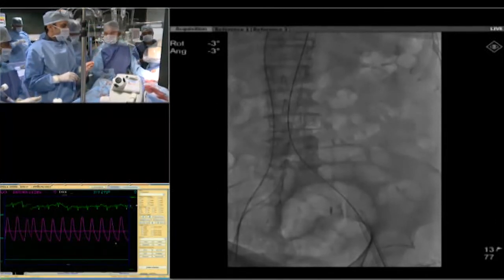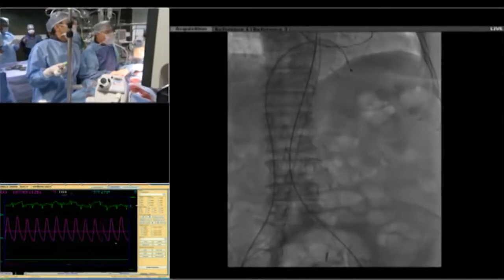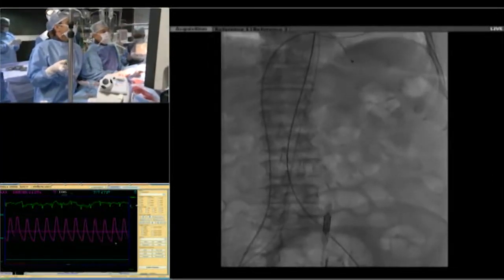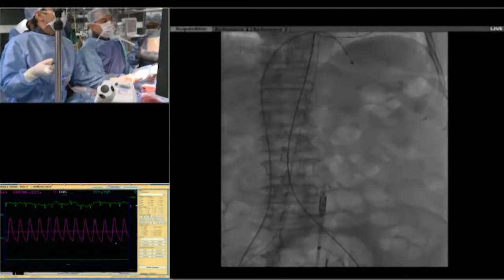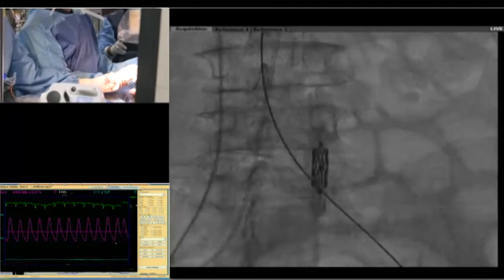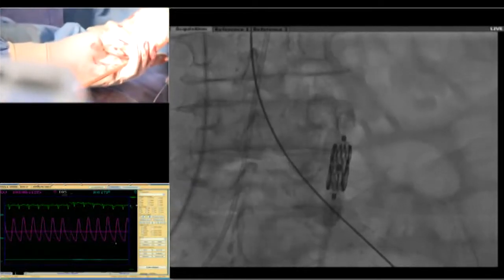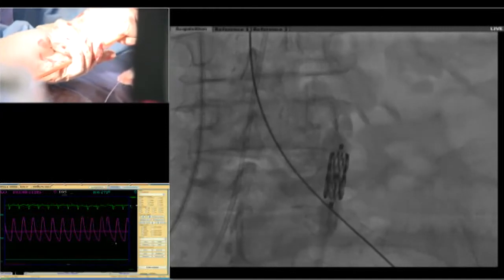So we're ready. All right, so we'll do a fluoro check of the valve. Let us see how it is loaded. It's loaded. Okay, mag up, please. Mag more. Mag more. Mag more. So now you can see 3 dots here, one right in the center and 2 on the ends. I think it's good. We see that very nicely. And the valve is loaded correctly.